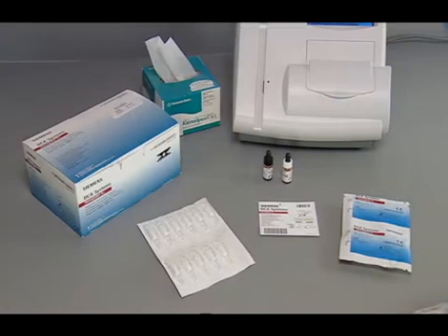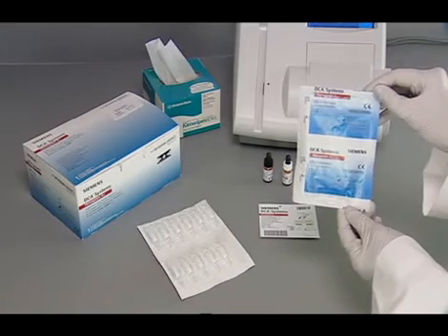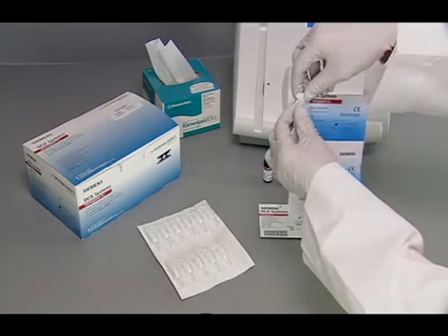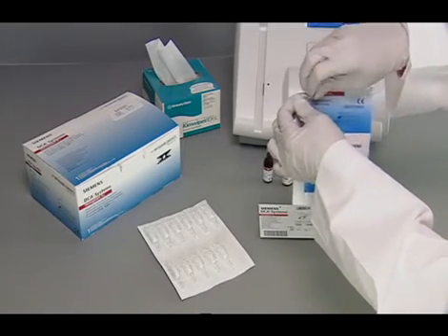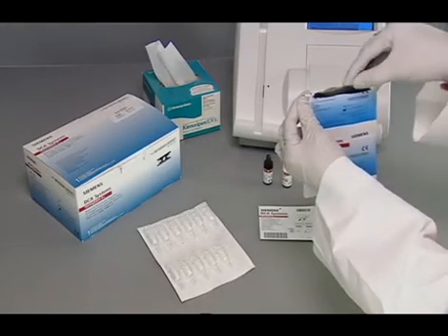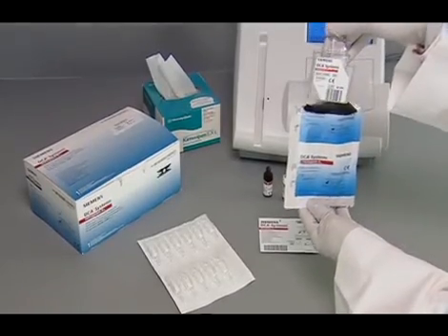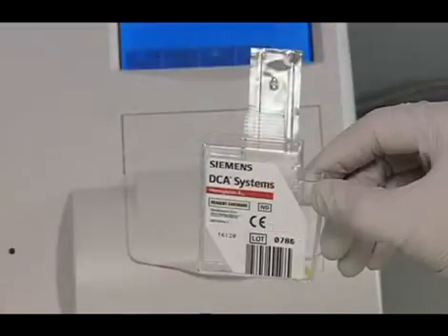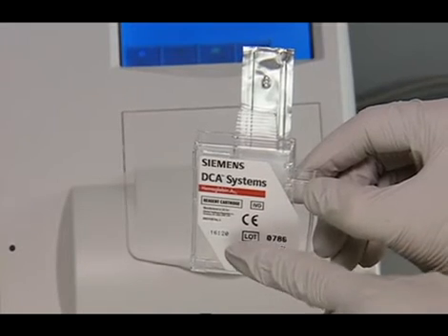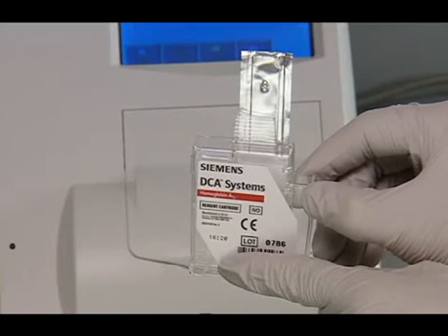Now you will learn how to remove the A1C reagent cartridge from the foil package. Remove one foil package from the reagent kit and open the foil package. Remove the reagent cartridge from the package. CAUTION: when handling the reagent cartridge, do not touch or otherwise contaminate the optical window, or erroneous test results may occur.